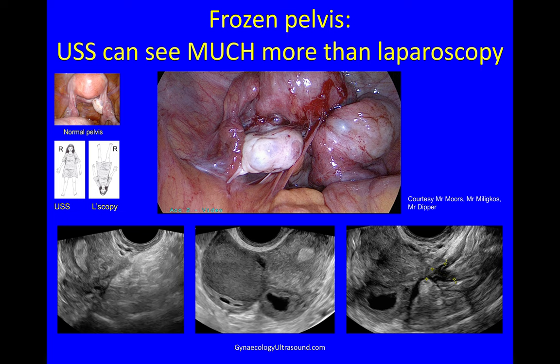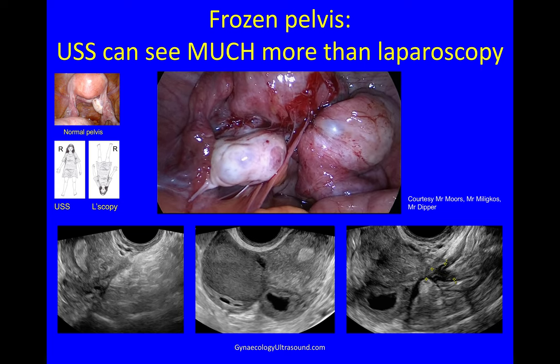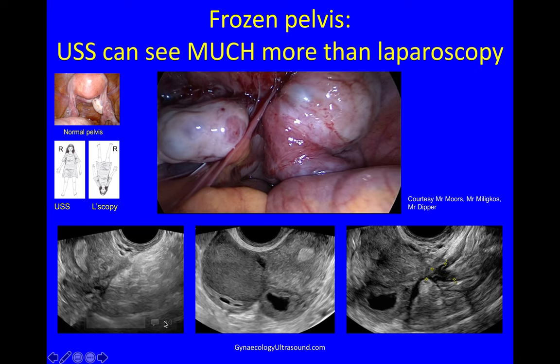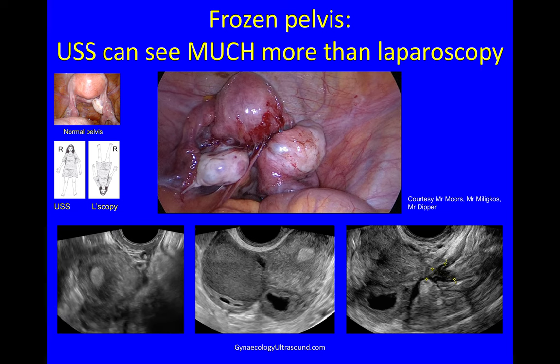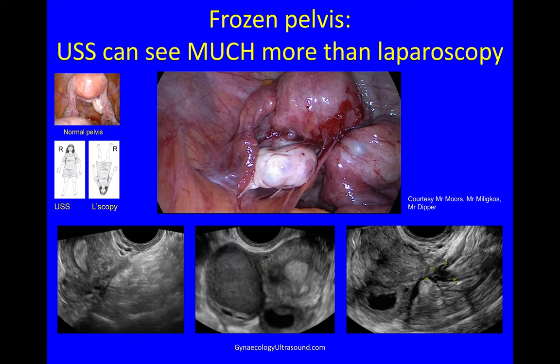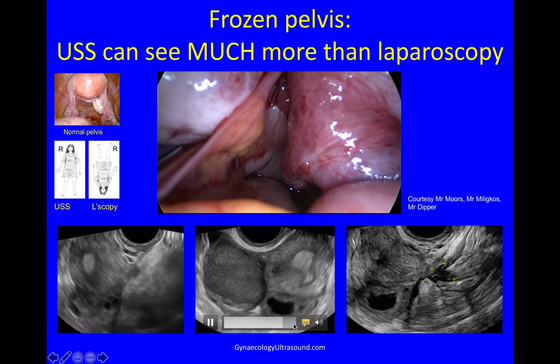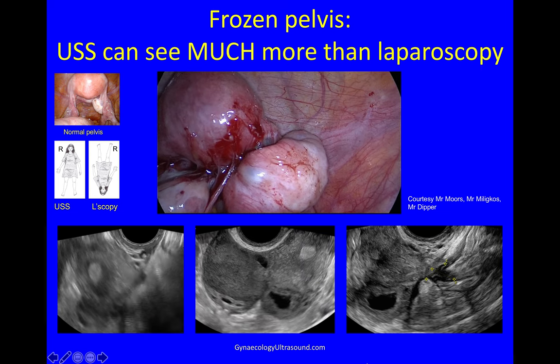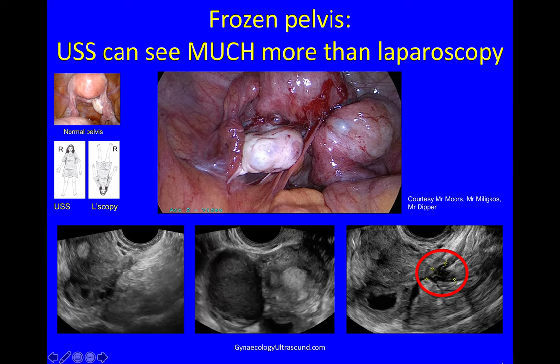With a frozen pelvis, ultrasound can see so much more than laparoscopy — remember at ultrasound and laparoscopy the images are the other way around. These are the ultrasound images of a patient with a frozen pelvis: in the transverse view you can see a big ovarian endometrioma and the other ovary — everything is glued to each other so they're kissing ovaries. But what you can also see that you would not know from laparoscopy alone is that she's got bowel endometriosis too.